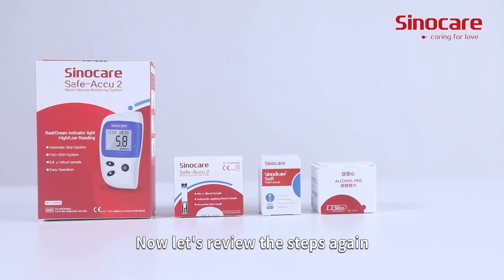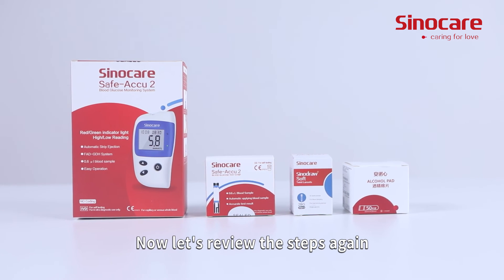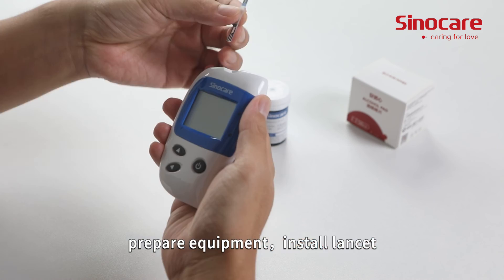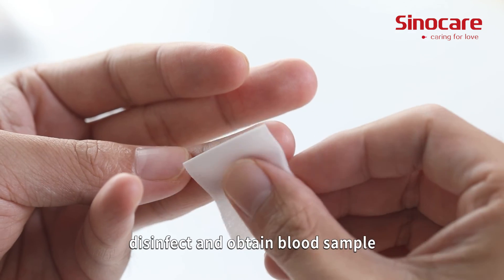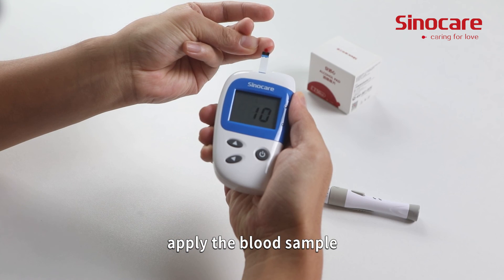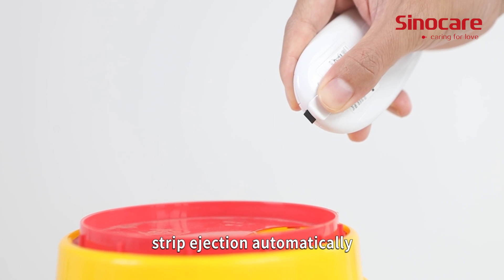Now, let's review the steps again: prepare equipment, install lancet, insert strip and set the device, disinfect and obtain blood sample, apply the blood sample, and strip ejection automatically.